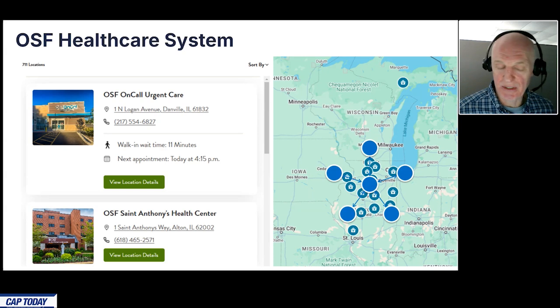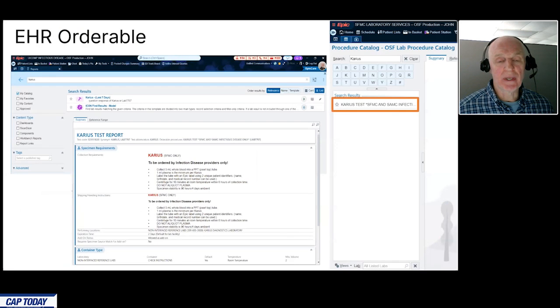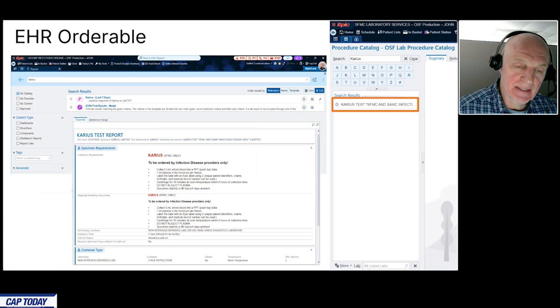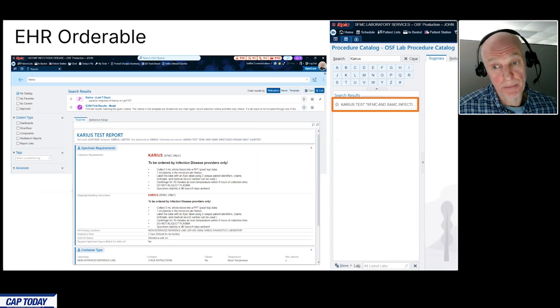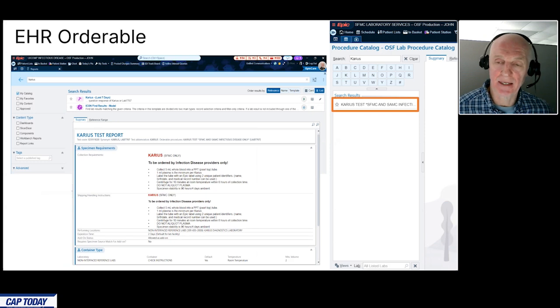Our serologies and chemistries are automated on the Abbott Architect track. And we're an Epic Beaker shop. Epic order entry and integrated EMR on the patient and provider side. Beaker lab resulting, reporting, and IT interfaced on the lab side.